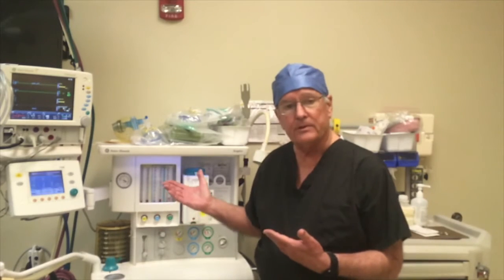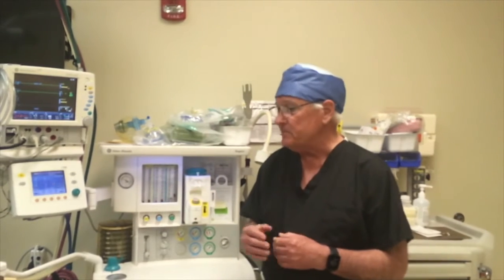We're here at the Eagle Eye Laser and Surgery Center in Meridian, Idaho, and in their operating rooms. We're going to show you how we can use a relatively dated, older type Omeda ventilator from an anesthesia machine to ventilate a patient with COVID with ARDS.